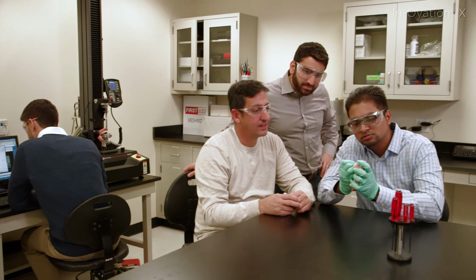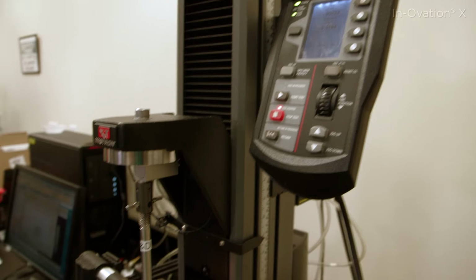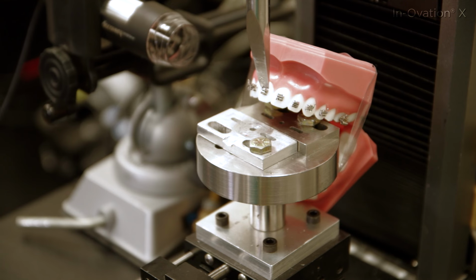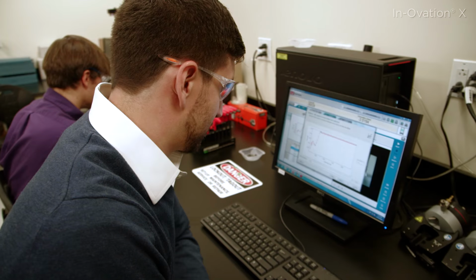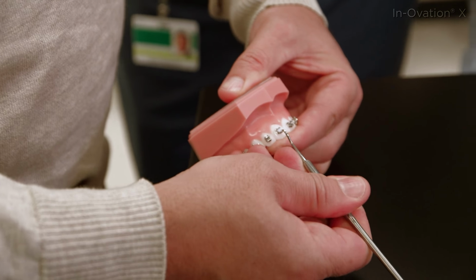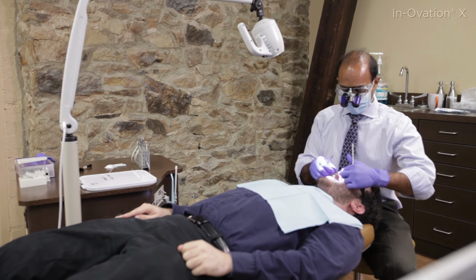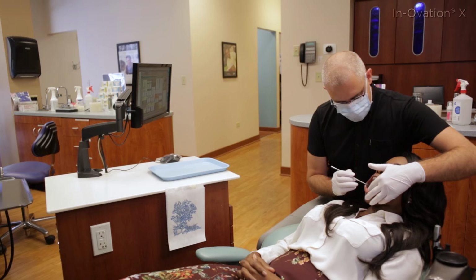When we develop a bracket, we work with prototypes, and we also do all kinds of mechanical testing to make sure the prototypes work functionally as designed. That's where the robustness comes into play, and the key for material selection as well as design is that you need that clip to open and close 50 to 100 times, and you don't want it to compromise treatment. But at the end of the day, you really need confidence that the product is meeting all the customer needs, yet providing the clinical outcome that it is designed for.